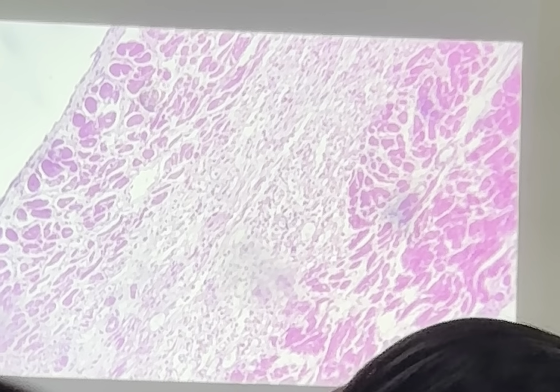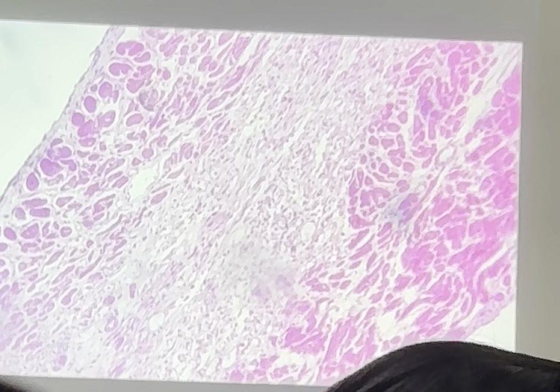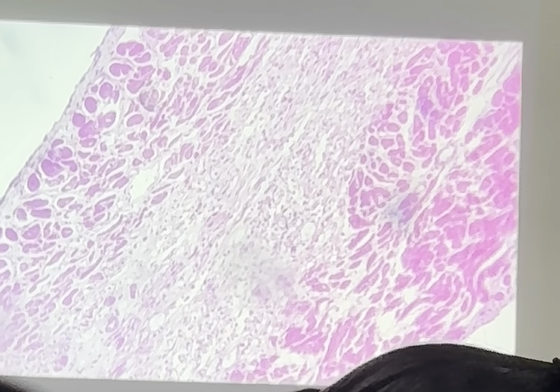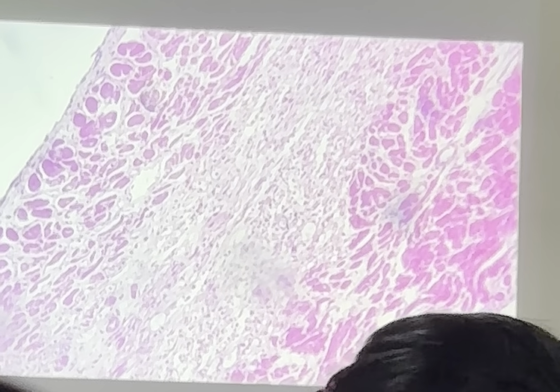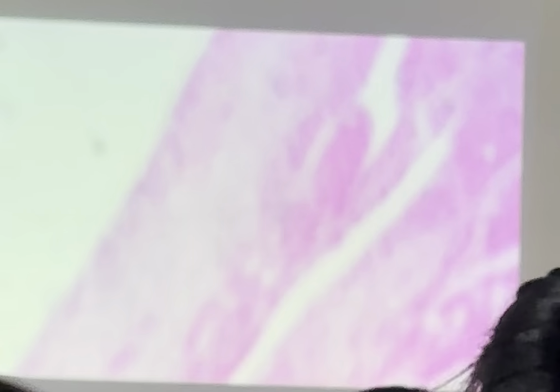And in the exams, you need to estimate the date of the myocardial infarction based on the population of the cells. Is it acute within a certain amount of hours? Is it already a chronic? This one is already a chronic one that's healed. Because it takes a long time for it to heal like this. Okay? So, myocardial infarction. Right? What else do we have?